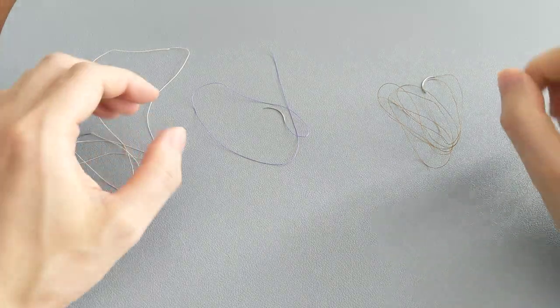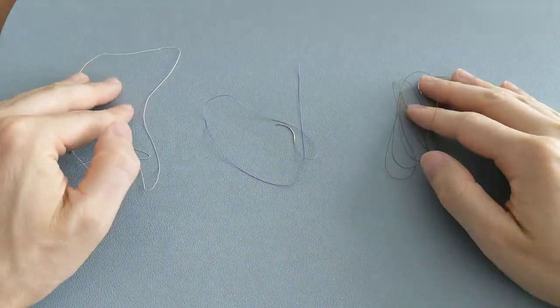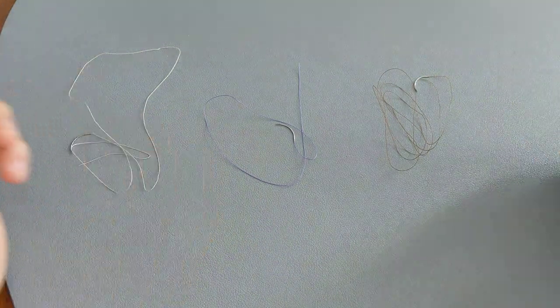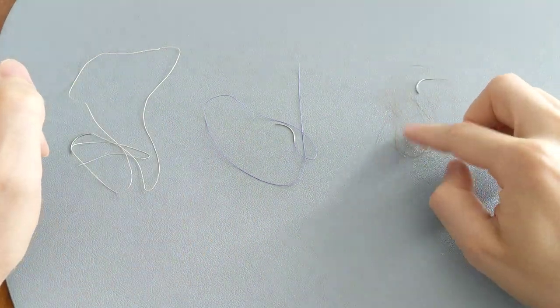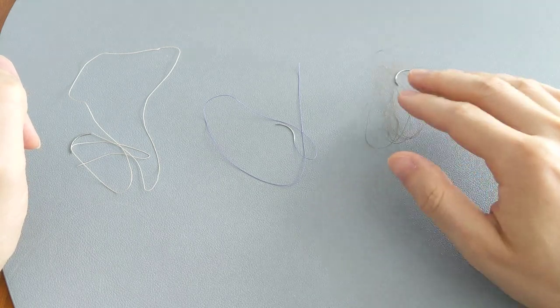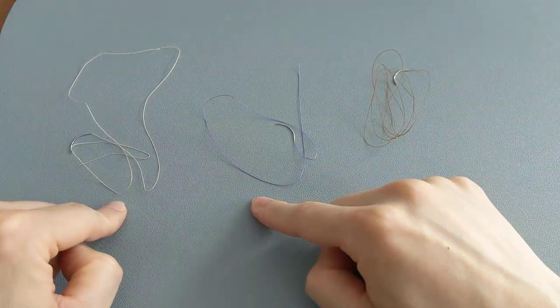This video is just to show you what our dissolvable stitches look like. Here we have the one on the right, which is an all-natural one made out of chromic gut, and then these two on the left are synthetic.